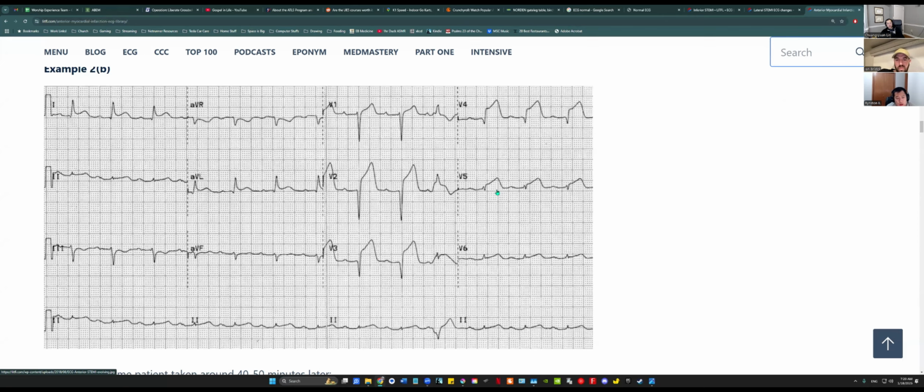Remember how we talked about relaxation being what's affected by no ATP, right? The heart has trouble relaxing. The T wave starts getting changed first. In fact, the T wave gets gigantic. So if you see a QRS that can fit inside a T wave, this is an early STEMI equivalent. If you look at the QRS spike and ever wonder to yourself, gee, that's really small, it looks like the T wave can eat it, that's a STEMI. I don't know if you think like that. That's the voice in my head.